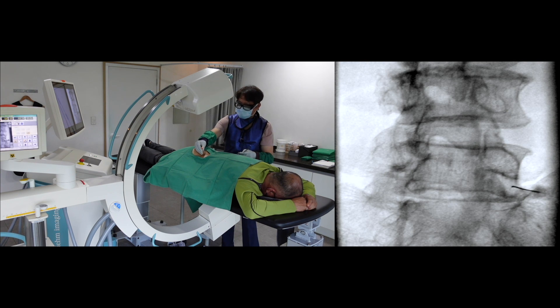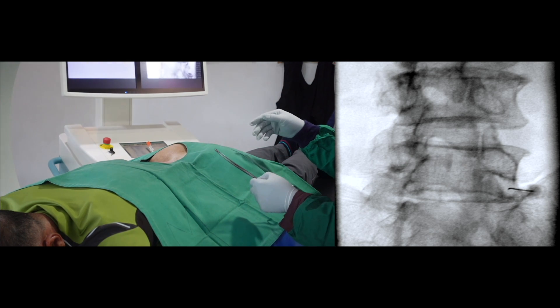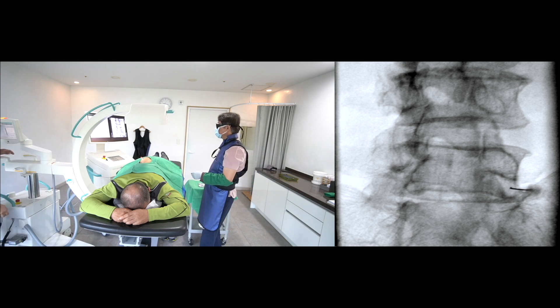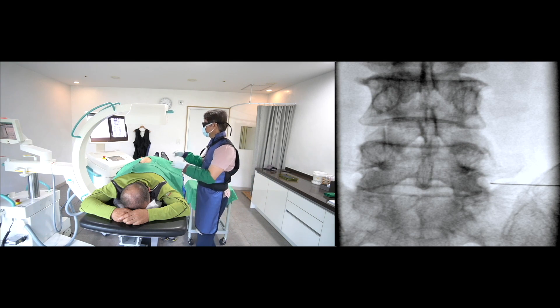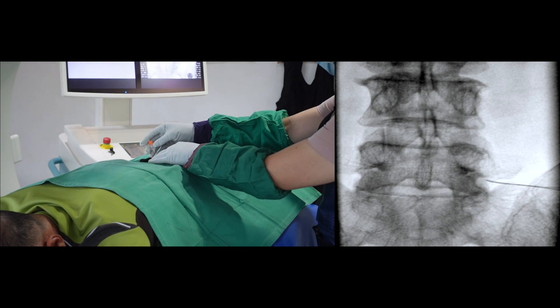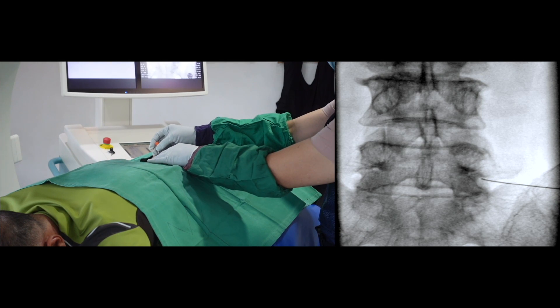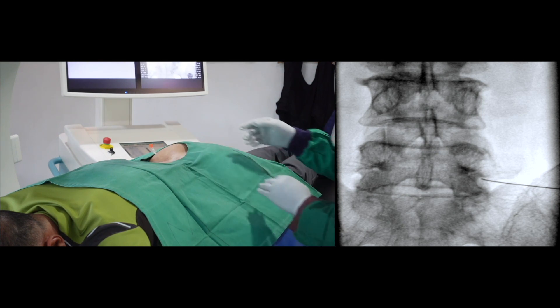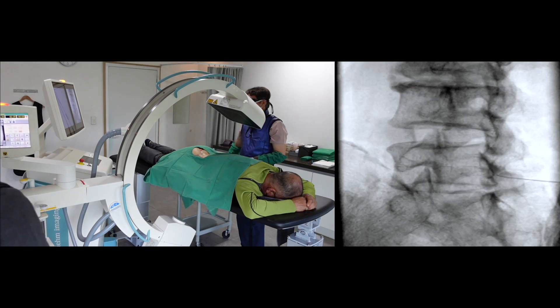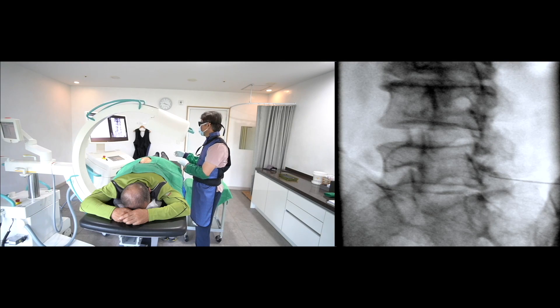I'll switch to my bare hand when the needle movement is straight. Usually it matches the deep muscle penetration. Please change to AP view if the needle touches the intertransverse ligament and redirect the needle along the inferior margin of the pedicle. Please fine-tune the final needle position by the contralateral oblique view.